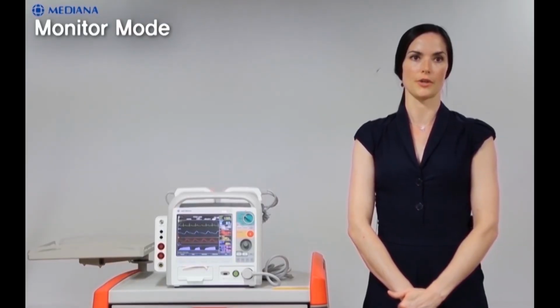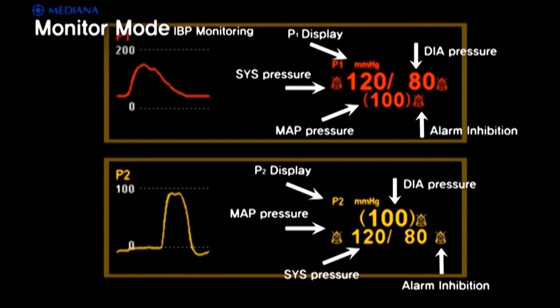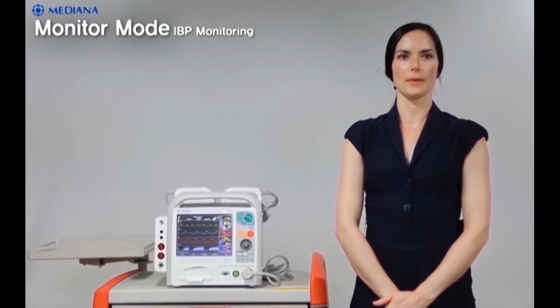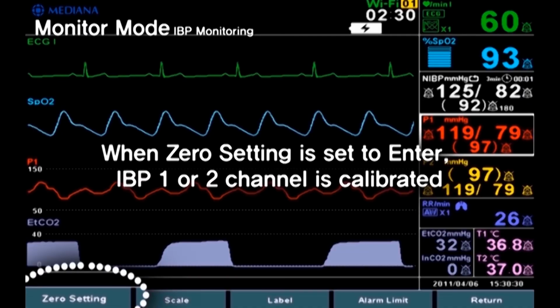The last monitoring parameter is IBP monitoring. Here you can see how the IBP measurements are presented on the screen. Now for a look at the IBP menu. Number 1. Zero setting. When zero setting is set to enter, IBP 1 or 2 channel is calibrated.